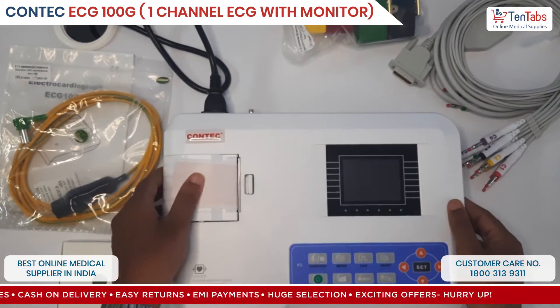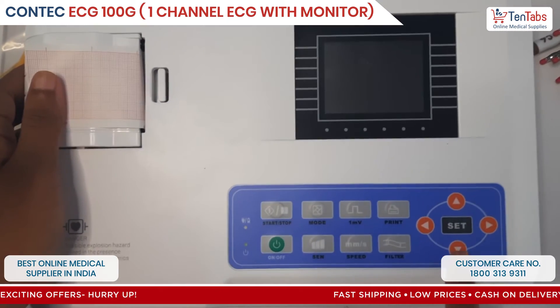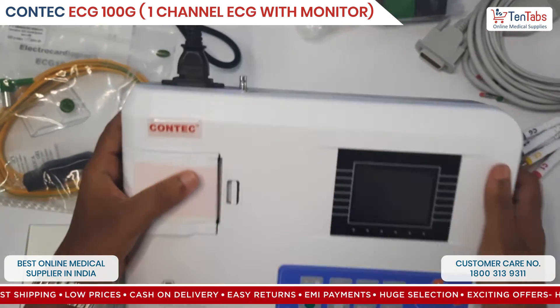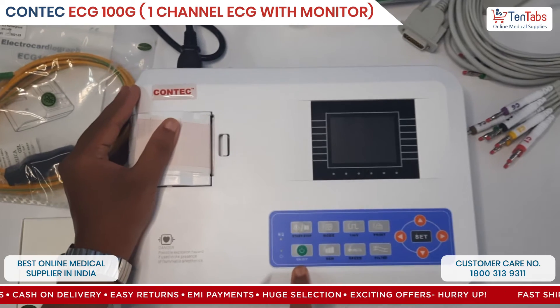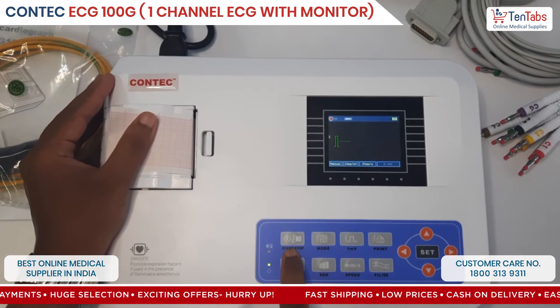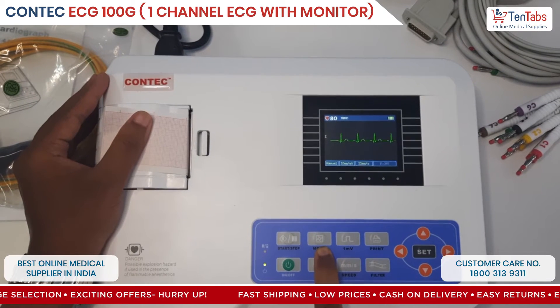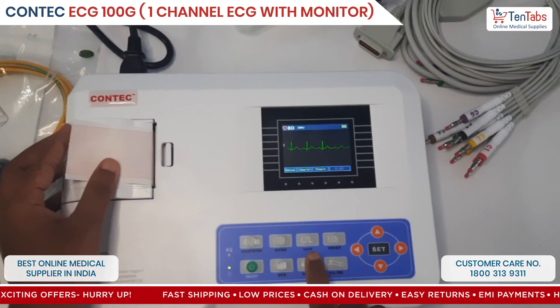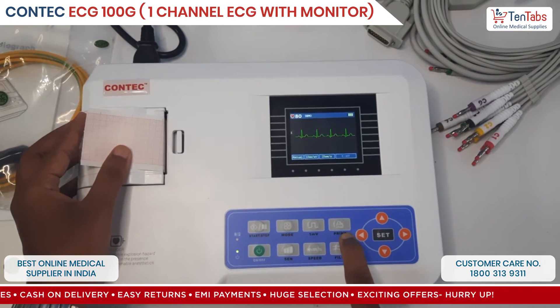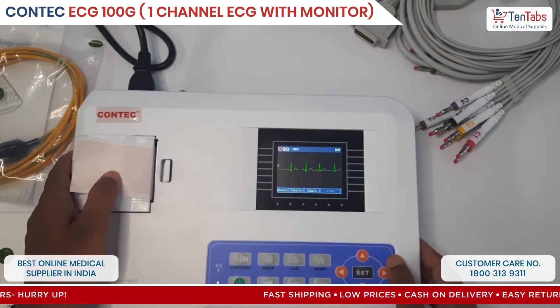The ECG paper roll is in, and this is the display screen. These are the functional buttons and the direction buttons. The power on/off button — long press to turn on. This is your start/stop button, basically like enter. This is to select mode: manual and auto. This is the calibration button, this is for print on and off, and this is for filter, speed, and sensitivity.